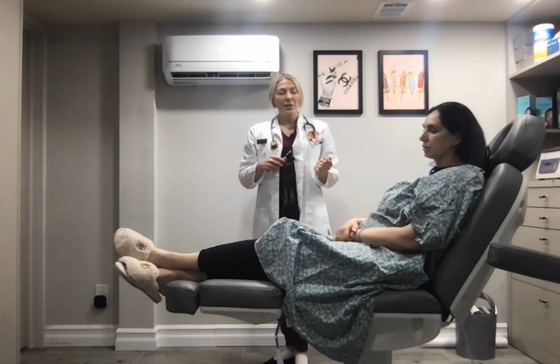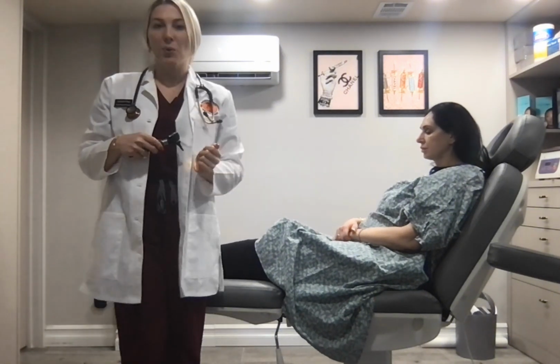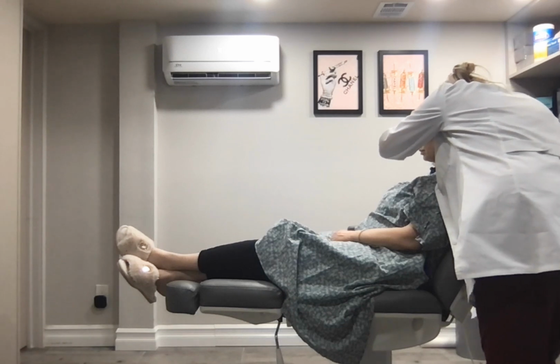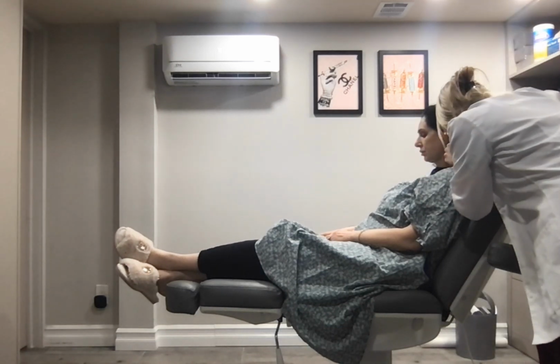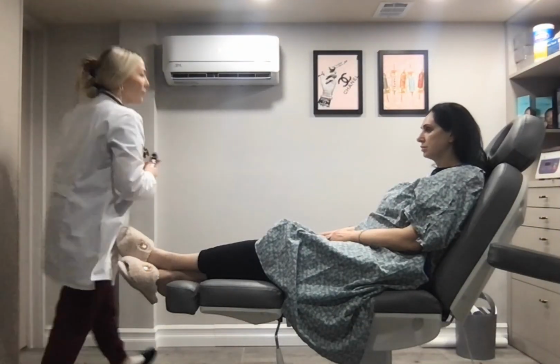It does not appear to have any fluid, and the tympanic membrane is nice and pearly gray. Okay, I'm going to be checking the other side as well. Do you have any tenderness or pain? No. No.